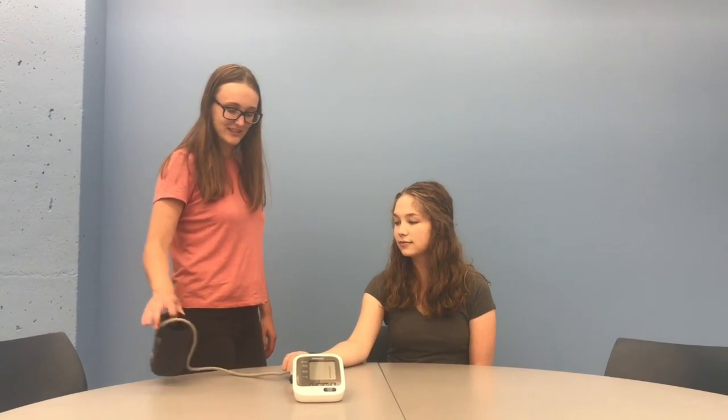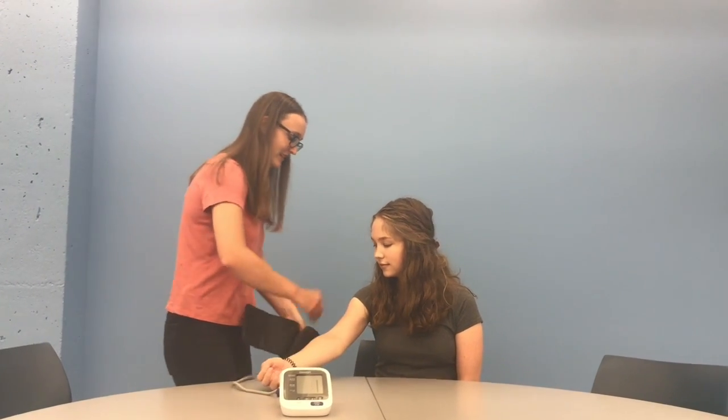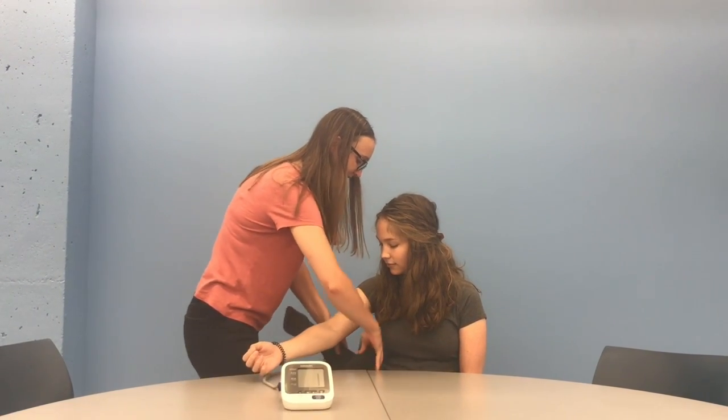Procedure: Participants should be seated with their right arm resting on the table. The bend at the elbow, also known as the cubital fossa, should be at heart level. Legs should be uncrossed and feet should be resting comfortably on the floor and not dangling.